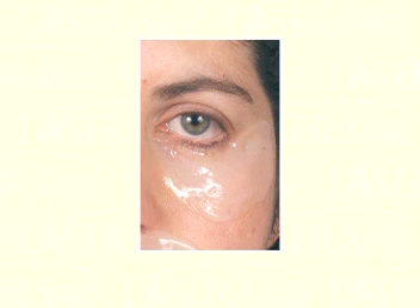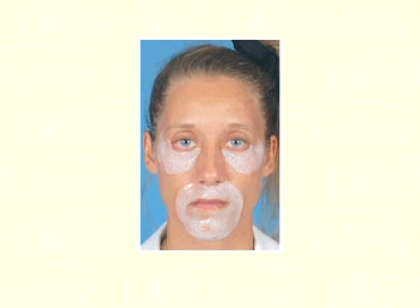Around the mouth, LaserSeal may separate from the skin as a result of talking or eating, requiring reapplication. LaserSeal can also be applied to segmental areas that have been resurfaced with laser or dermabrated — the lower eyelids or around the mouth, for example.